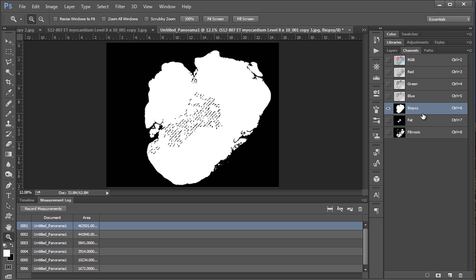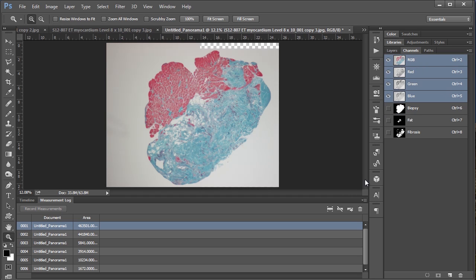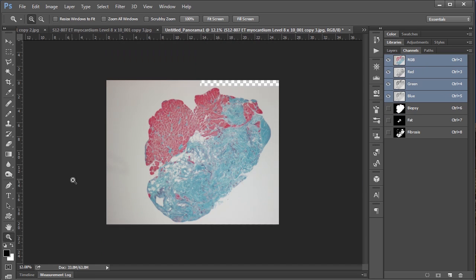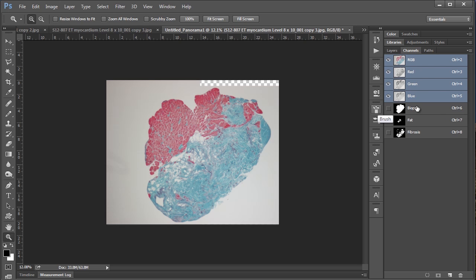And so basically once we have those three numbers, I'm not going to do it here, but just for example, to measure the area of the fat or the fibrosis in this heart you simply take those pixel counts. So for instance fat, the fat pixel count, and divide it by the number of pixels of the biopsy. And that will give you the percentage fat in this heart.